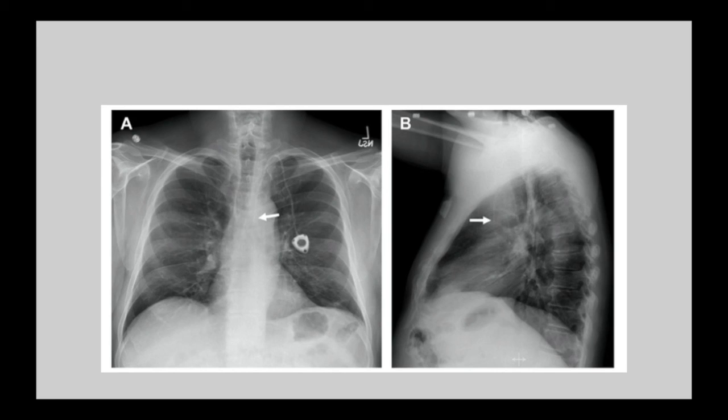Finally, another patient post-catheterization shows left paramediastinal position, but this catheter is not parallel to the descending thoracic aorta, rather the tip is within the descending thoracic aorta, or possibly the ascending thoracic aorta.